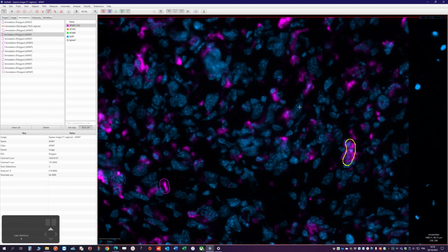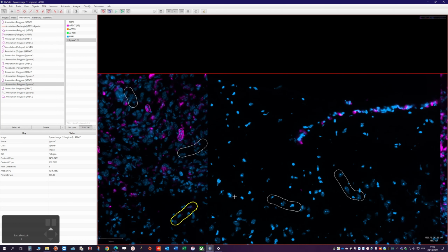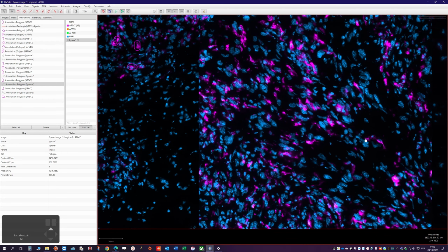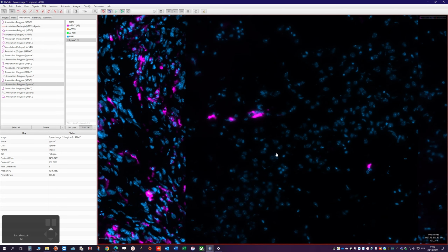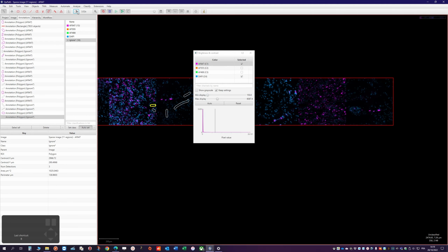Okay, like that. So let's use ignore. So those are definitely not positives. Those are not. Those have too little staining. Let's see. This. Something like that. Okay. Sorry. Like that. Select the whole image.